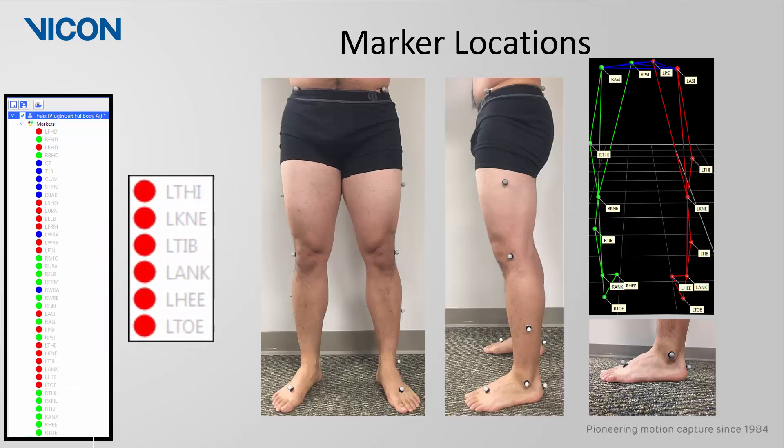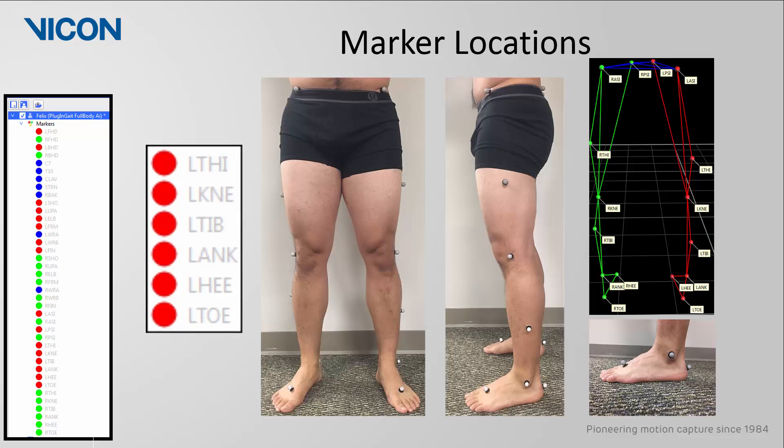Next, we have the left leg markers. Begin first by placing the left knee marker on the lateral side of the knee in the axis of flexion extension. Have the subject passively flex and extend the knee to better determine this location. Now imagine a line between the hip joint center to this knee marker. Locate the midpoint of this line and place the left thigh marker just distal to this point.